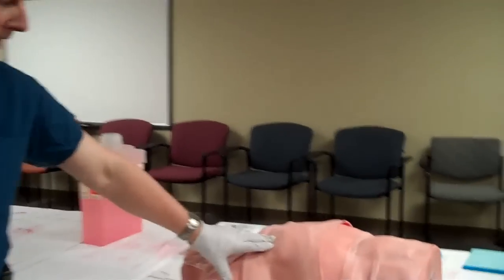The other thing that you should consider, since we again consider that there will be blood in the chest, is that it's a good idea to hook up an autotransfusion canister to the side of your chest tube collection system so that any blood that is shed can be reinfused if needed. Now, let's talk about the proper technique. We'll move over here to Trauma Man, who is our mannequin.